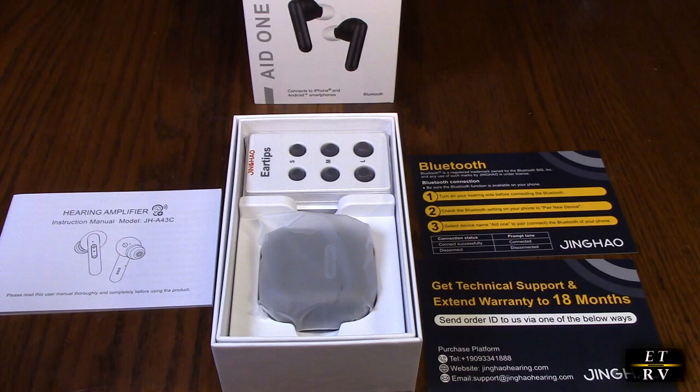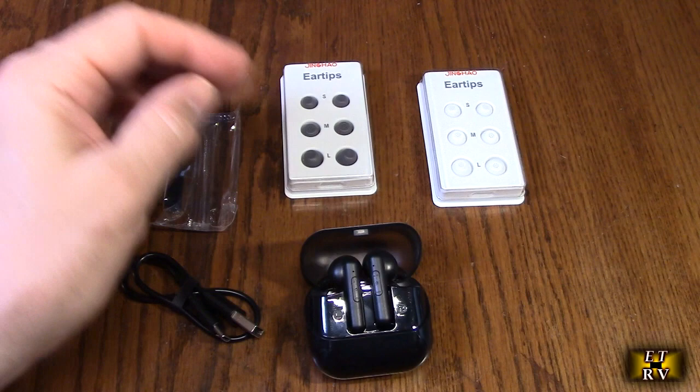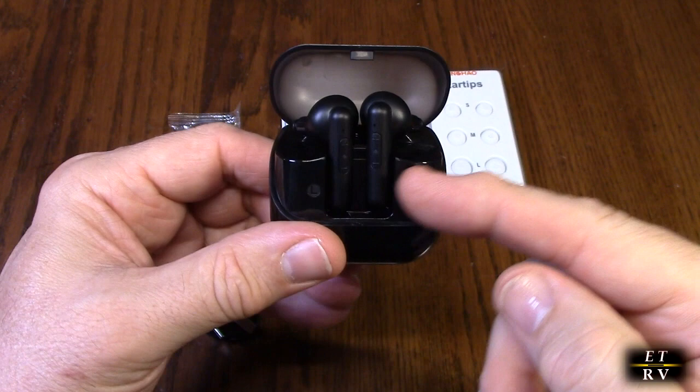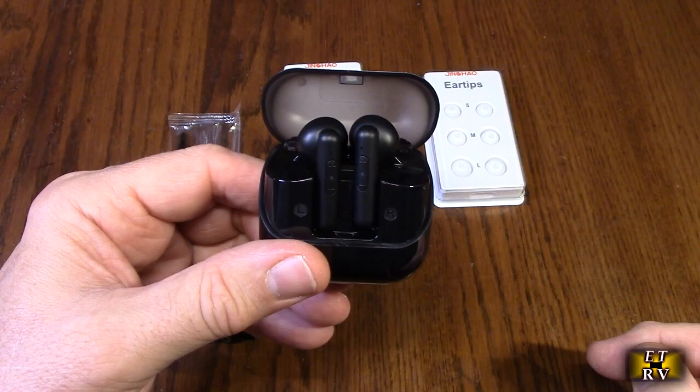Here's what's included: a little cleaning tool, a USB-A to C charging cable, ear tips in black, gray, and white in small, medium, and large, and the unit itself. You'll notice there's a charging port with USB-C — very nice quality. There is a right and a left hearing aid. This is not the style that goes over the top of your ear; it goes in the bottom of your ear into the canal, which is generally really comfortable to use.